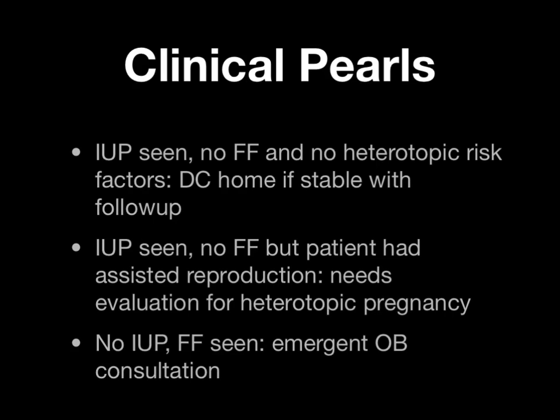So remember, focus at this point on intrauterine findings, both transabdominally and transvaginally, as well as cul-de-sac findings. In future modules, we're going to build on how to evaluate the adnexa more successfully. This now concludes the first trimester OB focused ultrasound lecture.